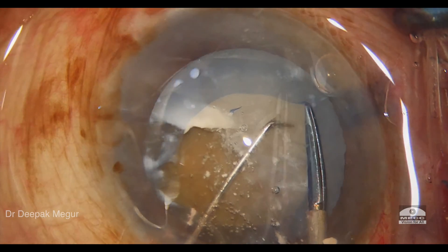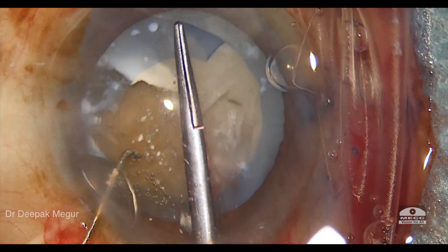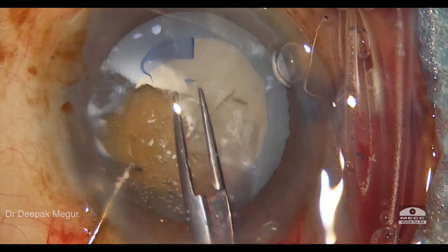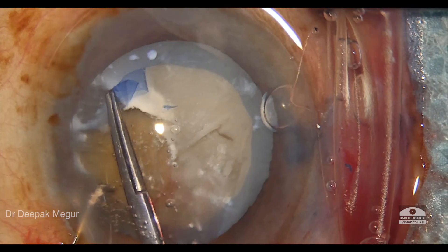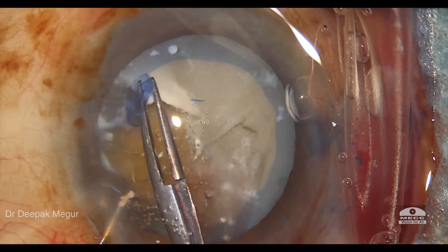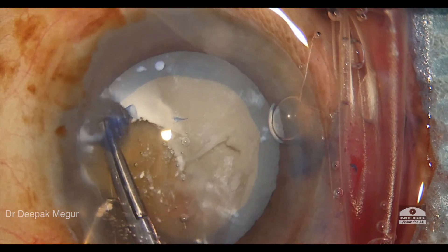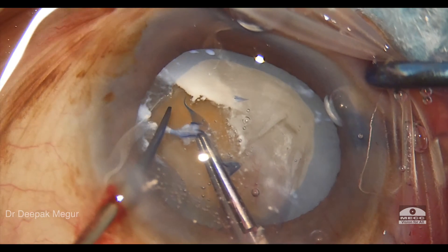Since I'm dealing with a slightly denser nucleus, I decide to enlarge the capsulotomy opening to a slightly bigger size, as it will make nucleus management much simpler and safer. Once we have a capsulotomy of adequate size, the last fibrotic band is cut open.